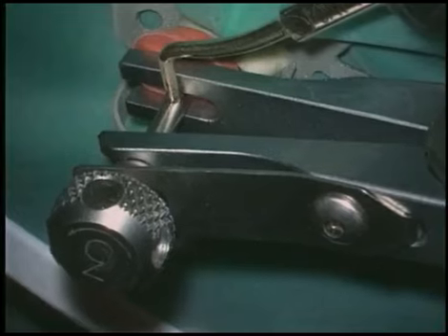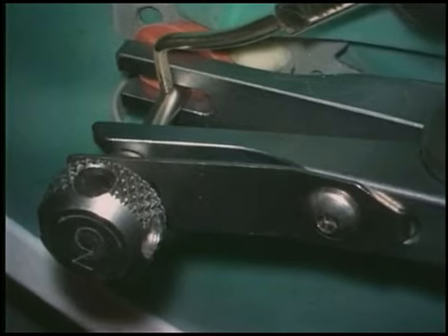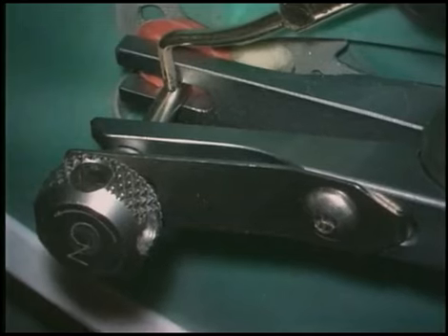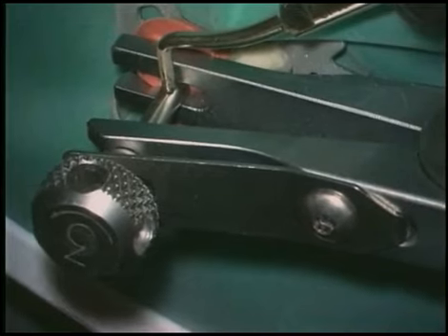Next, mount the extracting plier, and if the screw knob becomes difficult to turn, use indirect ultrasonics. Ultrasonics can be employed to further encourage the disintegration of cements. An audible pop sometimes can be heard as the post is loosened and removed from the tooth.